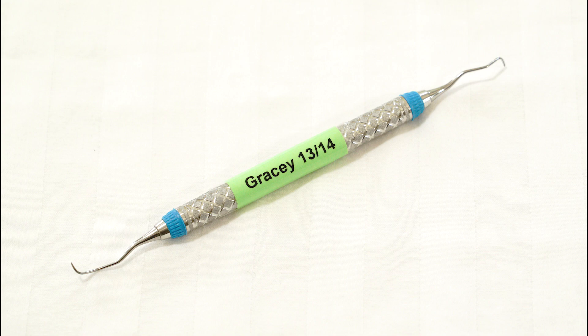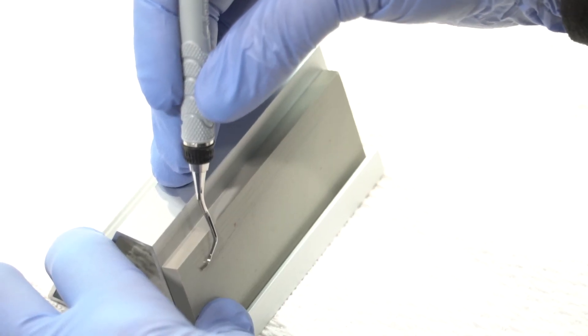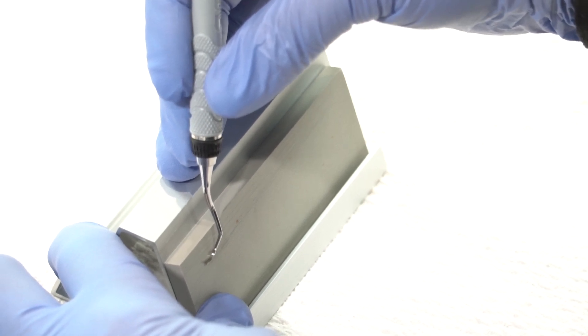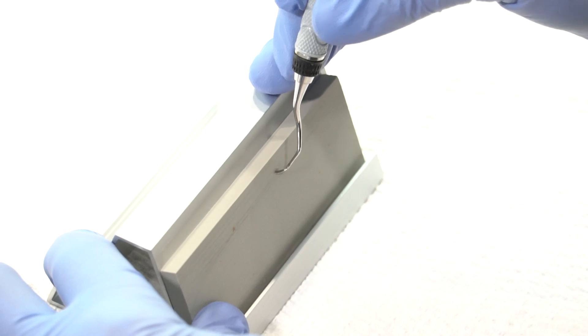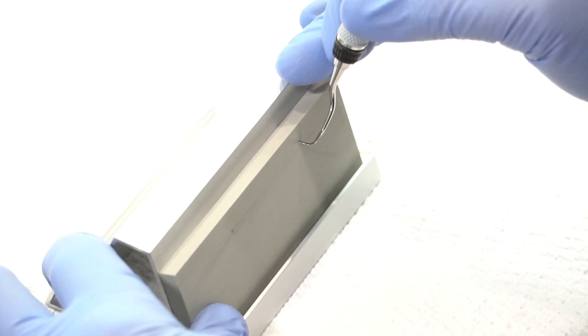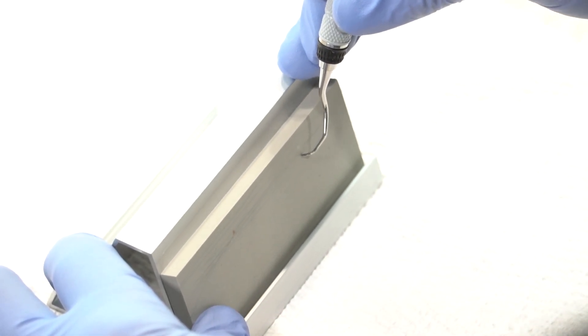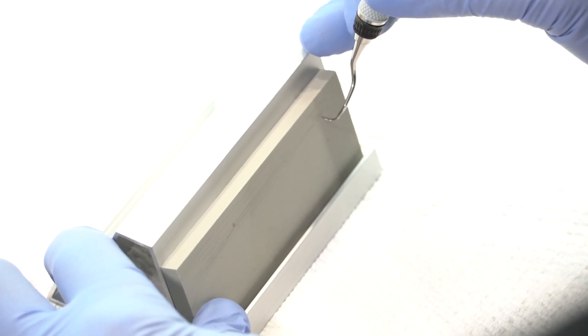This is the 13-14 instrument. You just need to place the heel against the stone, making sure the face is parallel to the tabletop. Start with the heel third, the middle third, the toe third, and the toe, keeping that parallelism on the toe, ending with the face parallel to the tabletop.